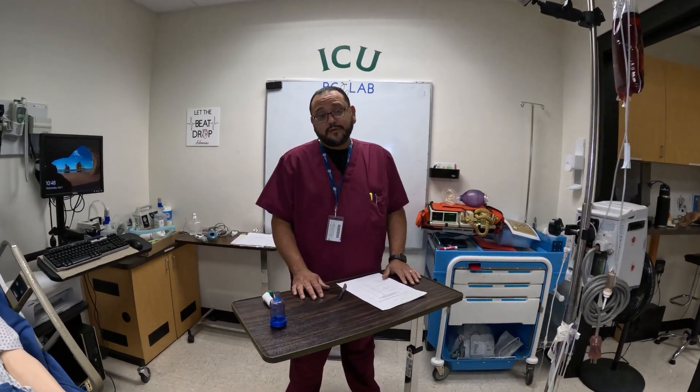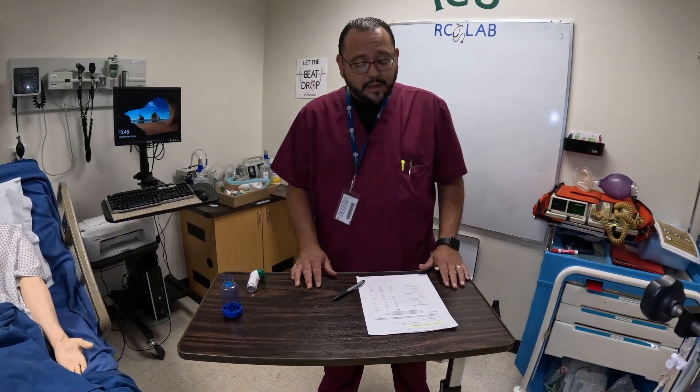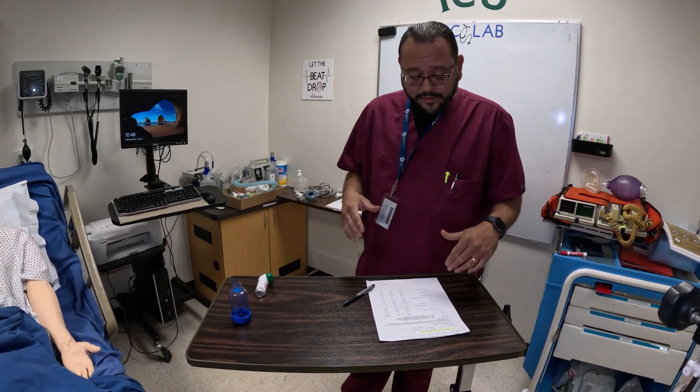We are going to do our competency for MDI administration. So of course we're going to check physician's orders first, check our patient's chart. I'm going to wash my hands and put on my correct PPE — whatever PPE I'm going to need, I'm going to put it on.